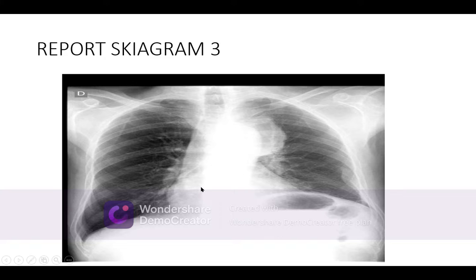So after inference, you write it down, whether you want to refer it, yes, you refer to the surgical team, or to a neurologist, whatever it is. But I will not refer.